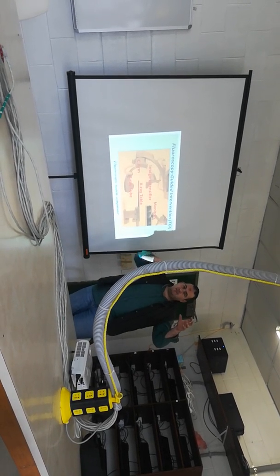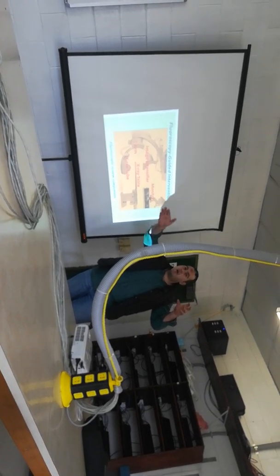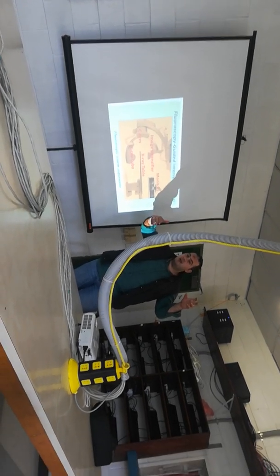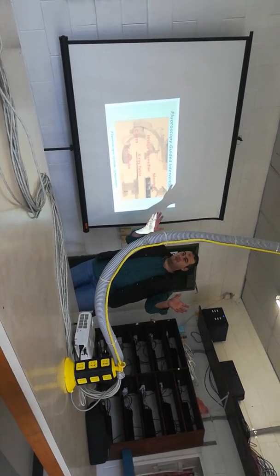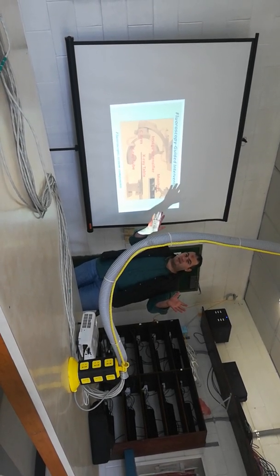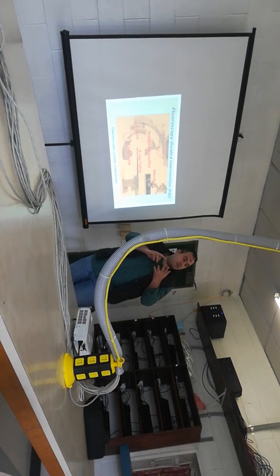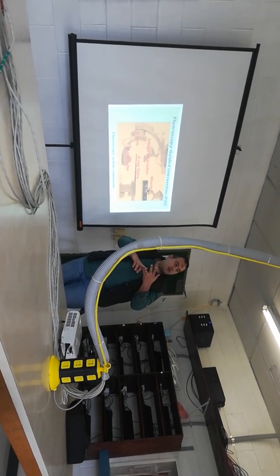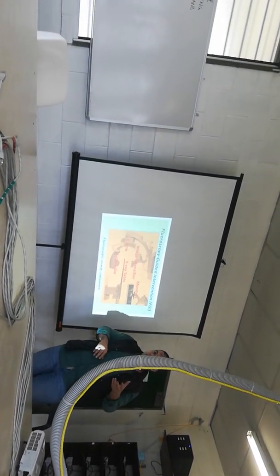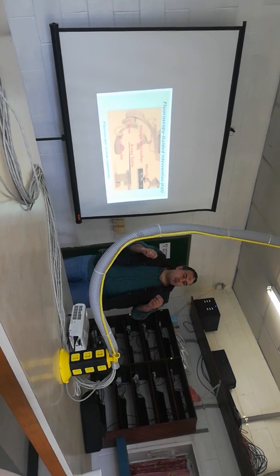If we increase the kV value, the penetration power of the X-ray will be increased. If we increase milliampere, the amount of X-ray photons will be increased. So kV and milliampere are the parameters affecting X-ray production in CR or any X-ray machine.